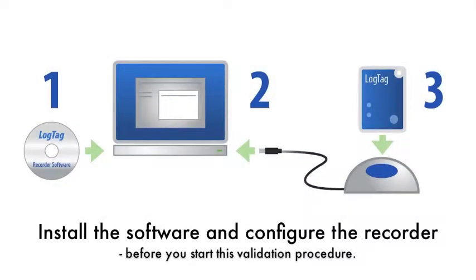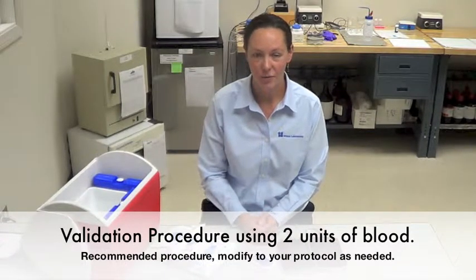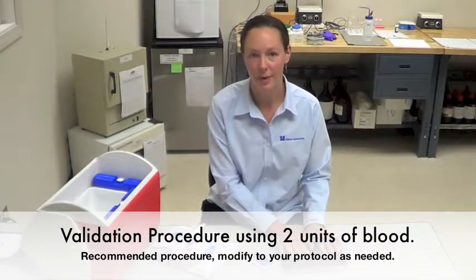Be sure to install the software on your computer and configure the temperature recorder before you start this procedure. In this short video, I'm going to review with you the validation procedure recommended for validating your cooler with two units of blood.